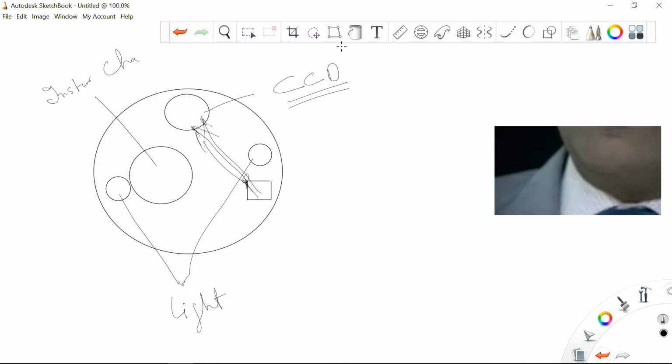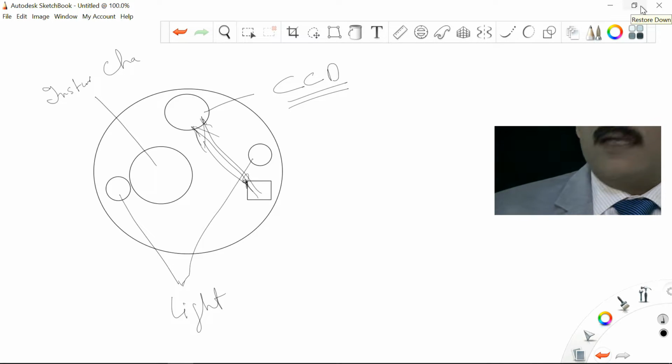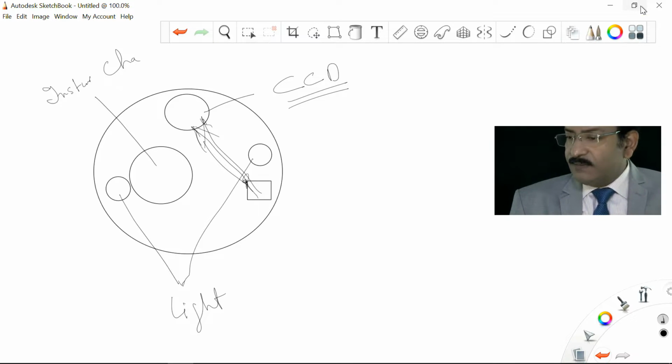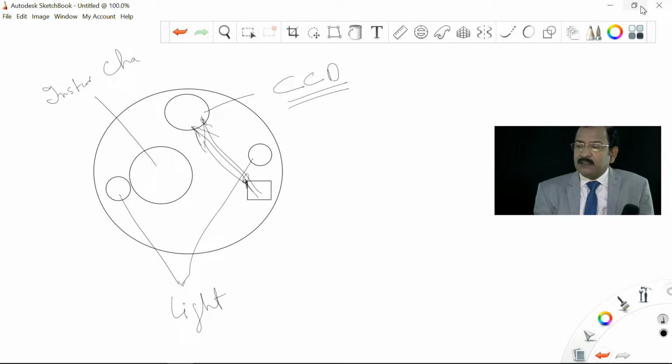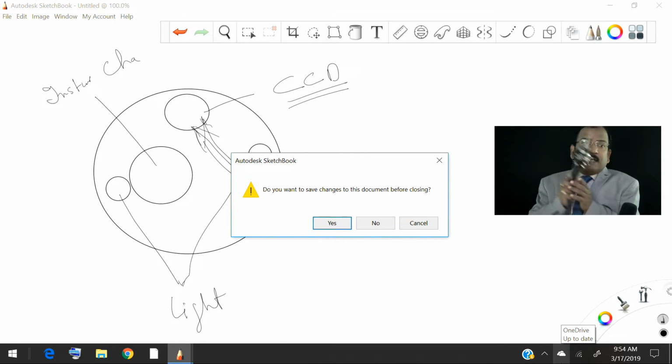Now coming to the umbilical cord. Take this part out of the processor and show the umbilical cord. So now we will see the umbilical cord of the endoscope. We have seen the control panel, the shaft, the tip, and now the umbilical cord. Umbilical cord is actually the layman term. It is basically an adapter. Take it out. This is on the back of the endoscope. So if you see the endoscope here, this is the other attachment, this is the adapter, and this is important. It has various parts which I would like to share with you. This is for taking light.